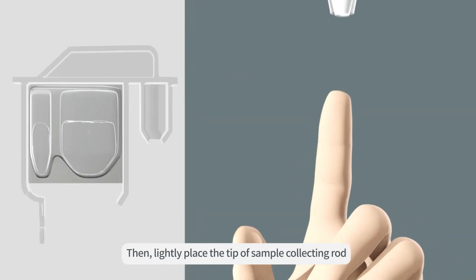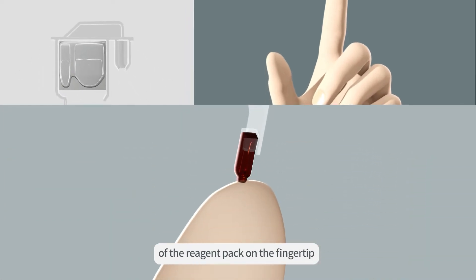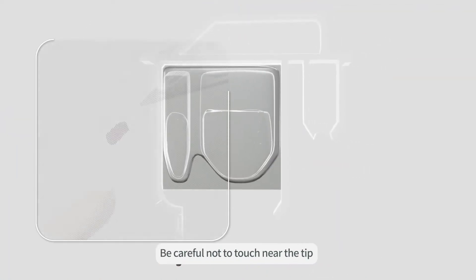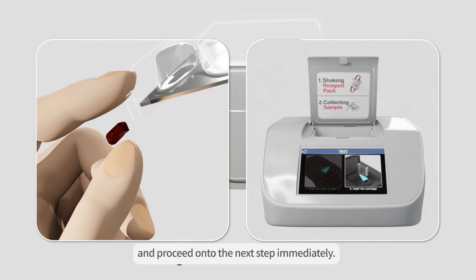Then, lightly place the tip of the sample collecting rod of the reagent pack on the fingertip to automatically draw the blood specimen. Double check if the specimen has been fully collected. Be careful not to touch near the tip and proceed to the next step immediately.